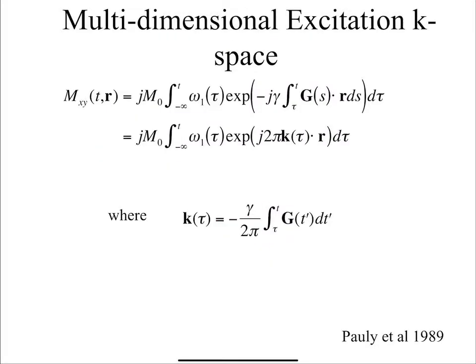The next few slides are just to give you a sense of how far you can take RF pulse sequence design. It turns out that you can actually get any pattern you want by designing the gradient and the RF pulse in the proper way. You use the gradients to go through k-space, and then you weight that trajectory. This is going to be your gamma times your B1.